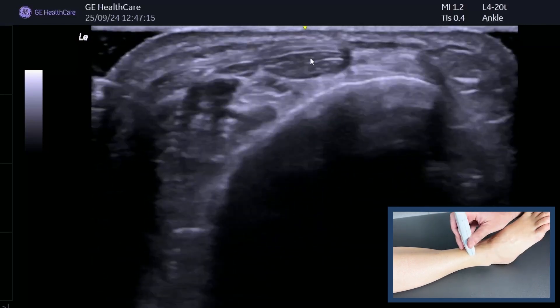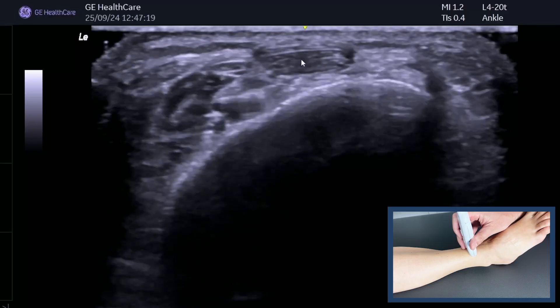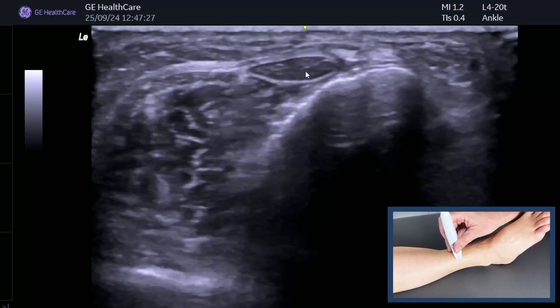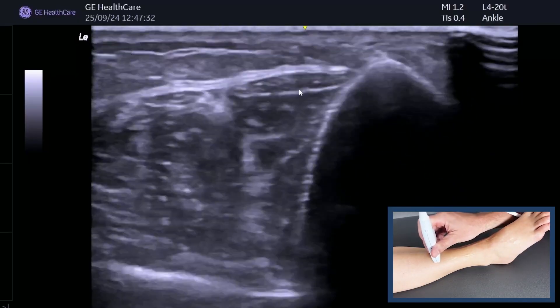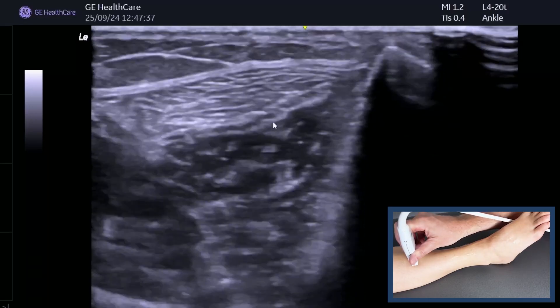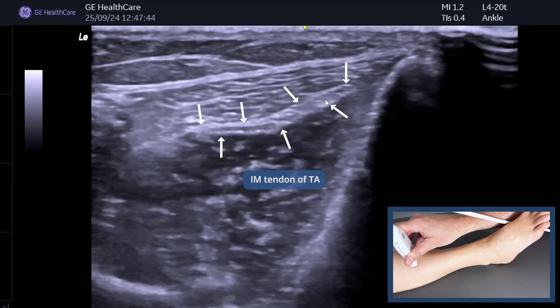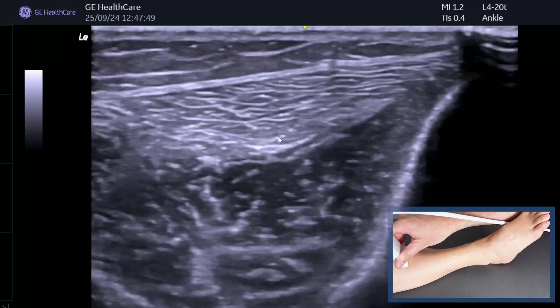Place the probe in transverse section and you can see tibialis anterior in the middle. Now I want you to explore what happens to tibialis anterior as we move up — you can see the retinaculum on top keeping it in the middle. Keep tilting the probe and what happens is this tendon actually goes inside the muscle. You can see this is the intramuscular tendon — just tilting the probe to avoid anisotropy.